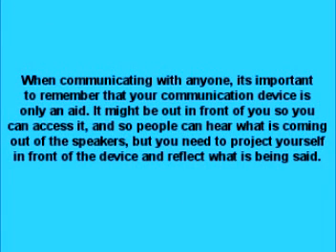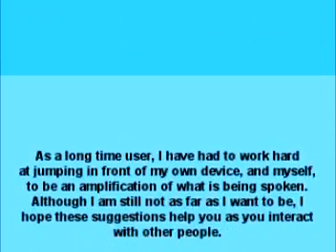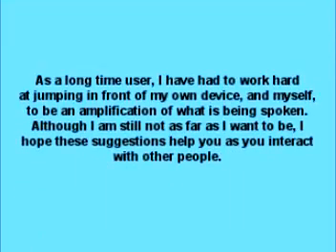When communicating with anyone, it's important to remember that your communication device is only an aid. It might be out in front of you so you can access it, and so people can hear what is coming out of the speakers, but you need to project yourself in front of the device and reflect what is being said. As a long-time user, I have had to work hard at jumping in front of my own device and myself to be an amplification of what is being spoken. Although I am still not as far as I want to be, I hope these suggestions will help you as you interact with other people.